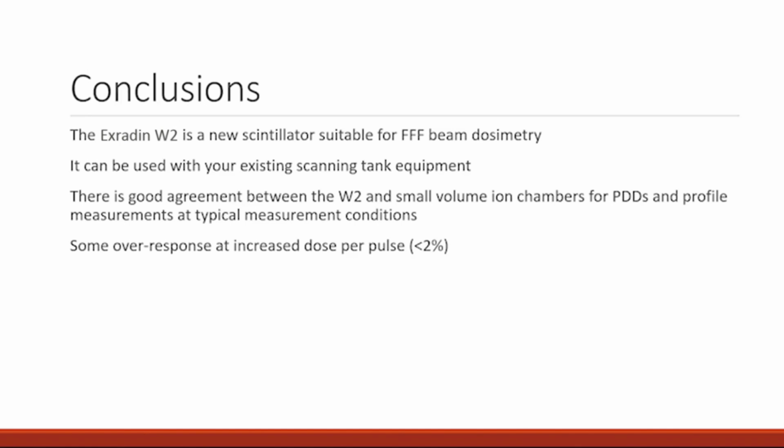But we did some trial and error and found a way, I think it was adaptive normalization, that did a really good job smoothing it without affecting the shape of the curve.